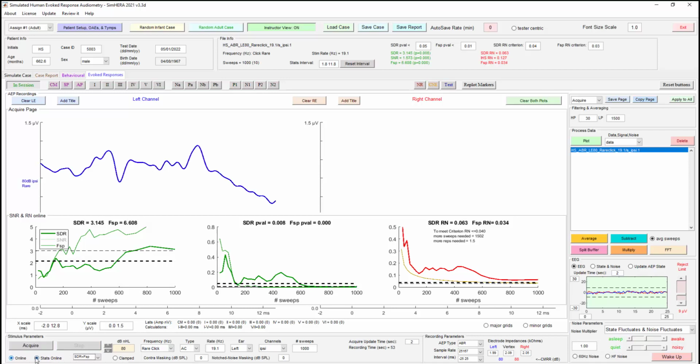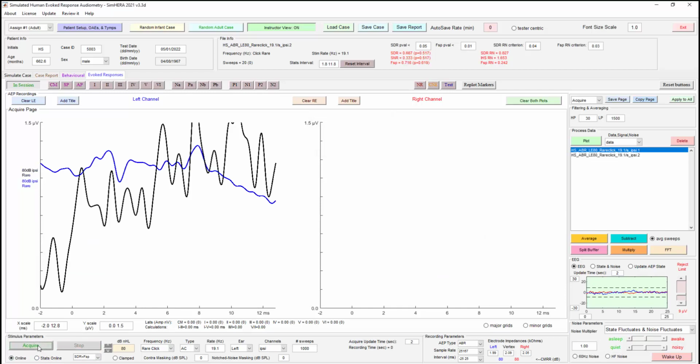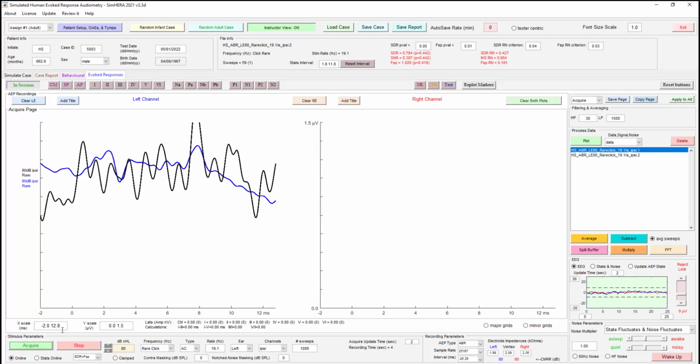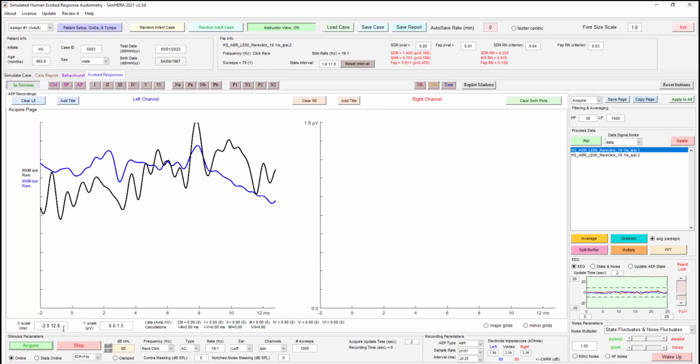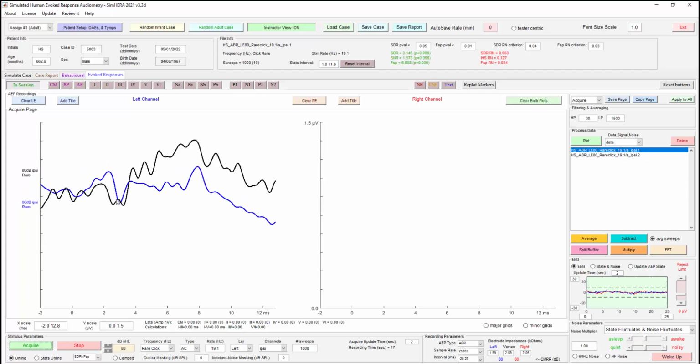Okay, there's our first recording. I'm just going to turn stats off for here, and we'll do our second recording. You can click and drag these waveforms while it's recording, but don't hold and drag it for a bit.